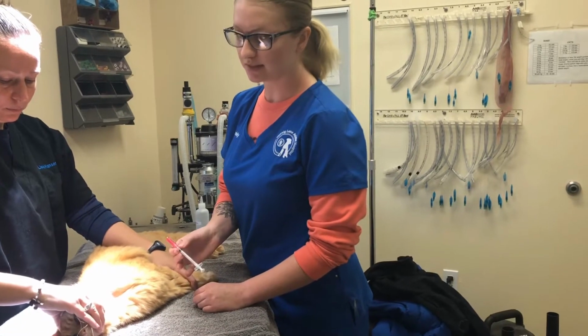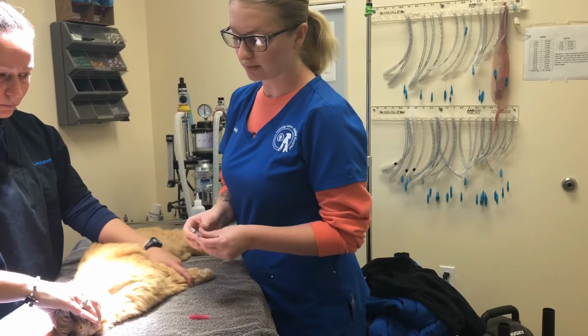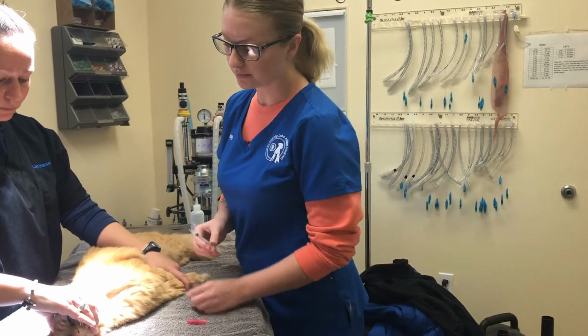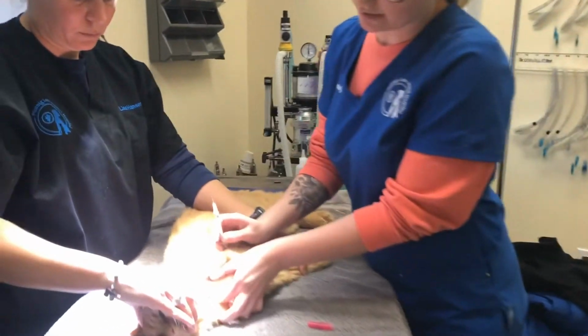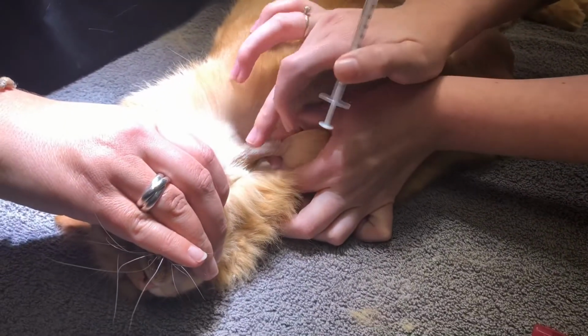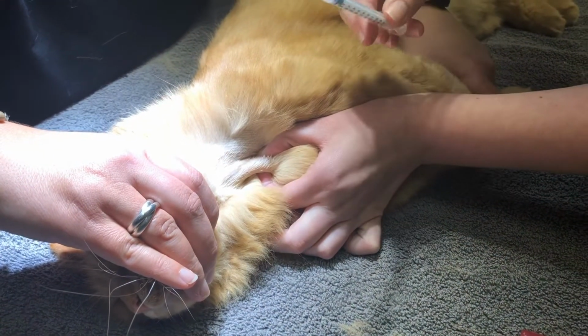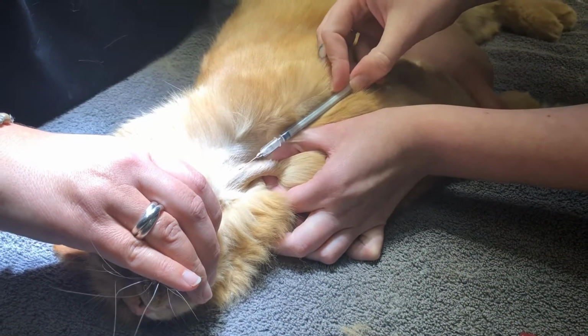I'll go in with a 1 cc syringe and a 25 gauge needle. Cats tend to have smaller veins than dogs, so we'll use a smaller needle. And then I will occlude the vein by pushing in to the jugular furrow. And when I visualize the vein, I'll insert the needle.